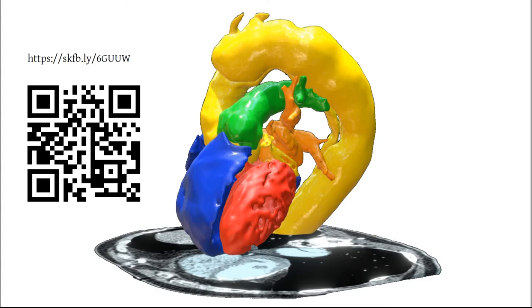And we have a tetralogy of Fallot model here as well. It's normal morphology, general orientation. Just that the valves are a bit stenotic, but it has the right chambers and in the right orientation.